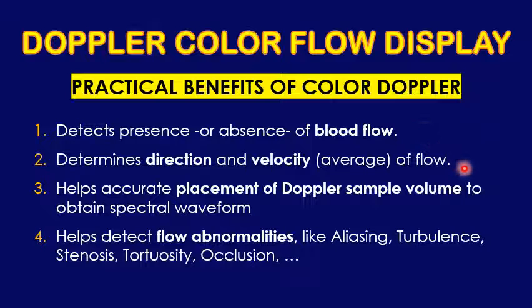It determines the direction. Is it positive or negative? Is it red or blue? Is it towards or away? So the presence of blood flow is the first, and the second thing is the direction and the velocity of the flow.